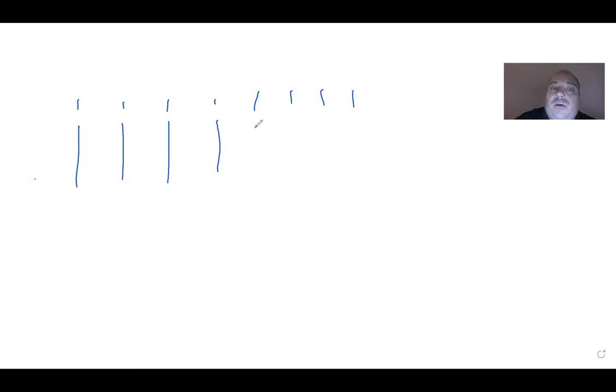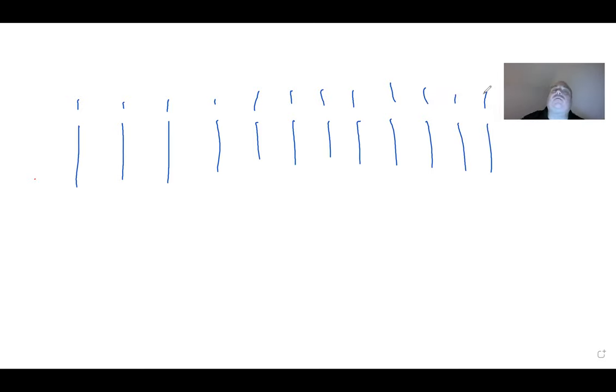So if you did have a long strip of a whole bunch of complexes and they continued to march out, as we say, with the same type of pattern, okay? That's what we mean by marching out. It's kind of hard to draw on a computer or explain on a computer. But it basically means that they're following the same pattern, okay? If something all of a sudden deviates from a pattern, then it would not march out, as we say. All right, so that's what we mean by that.